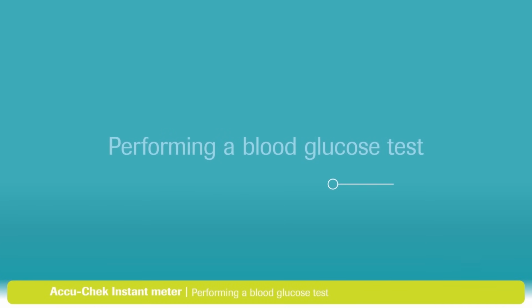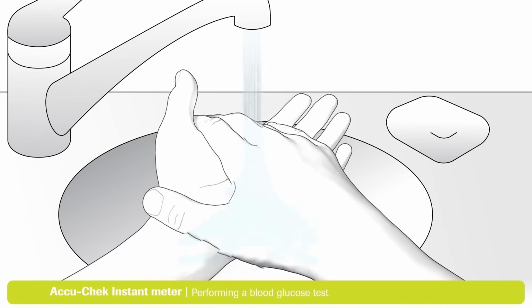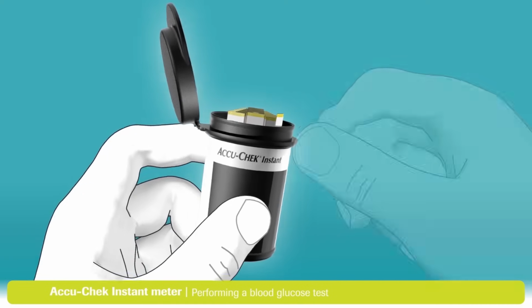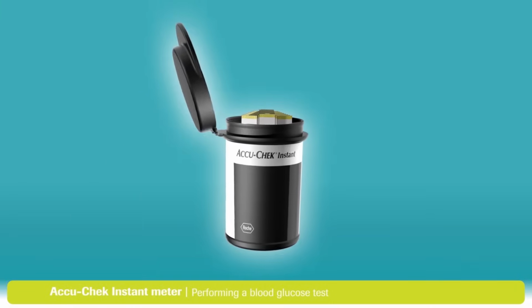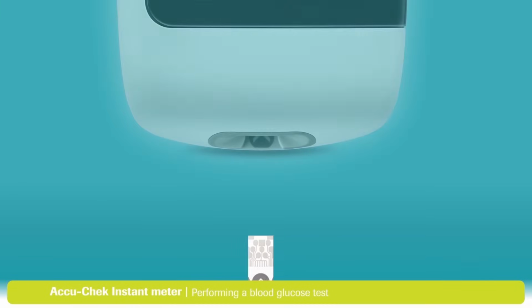Now you're ready to do a test. First, you'll need to choose a finger to take a sample from. It's best to alternate between fingers as they can become sensitive over time. Remember to always wash your hands with warm soapy water and dry them thoroughly before you test. Remove a test strip from the test strip container. And always remember to close the lid tightly. This helps protect the remaining strips.